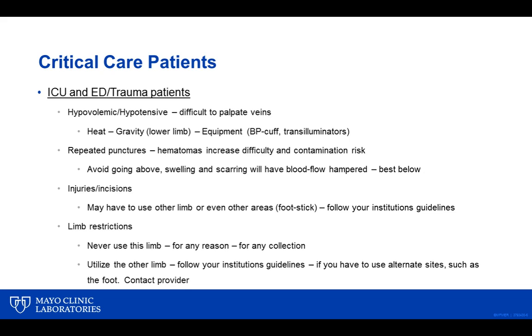Limb restrictions. You never want to use that limb for any reason, for any collection. Utilize the other limb if you can. Go to that one right away. If you do have to go to a foot stick, you'll want to contact your provider.